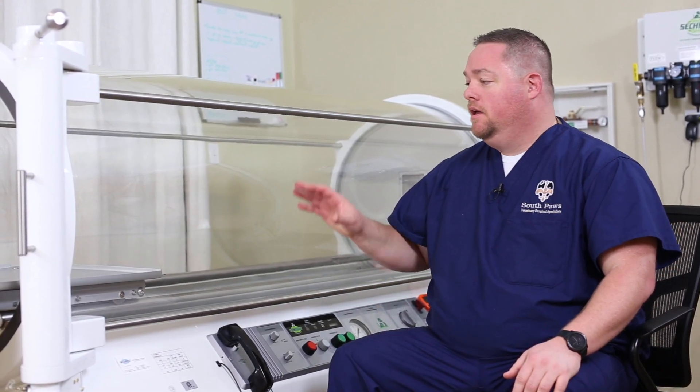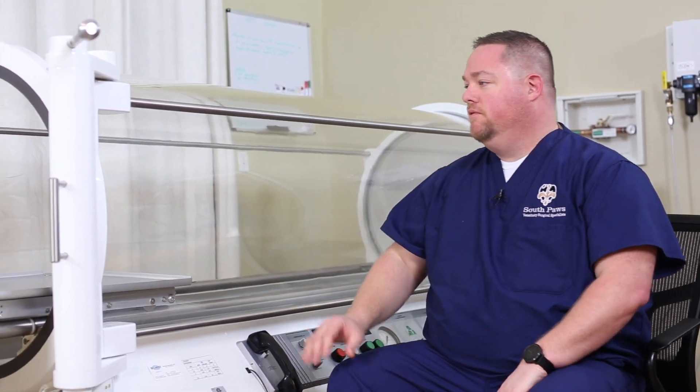Hey guys, I just wanted to show you the new Sechrist chamber that we have here at South Paws. Just some of the new features. We've been doing hyperbarics for about three years now, but this new chamber has some really great things that we love, and I just wanted to point out a few of them.